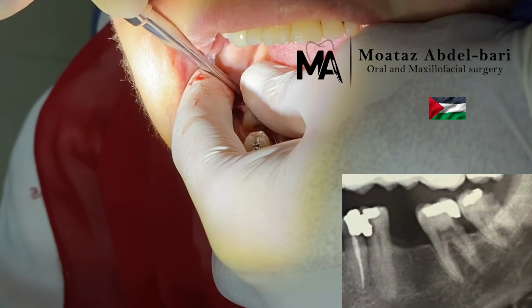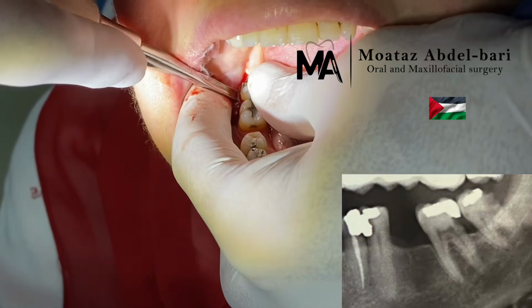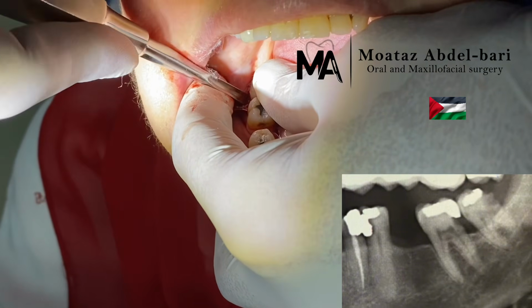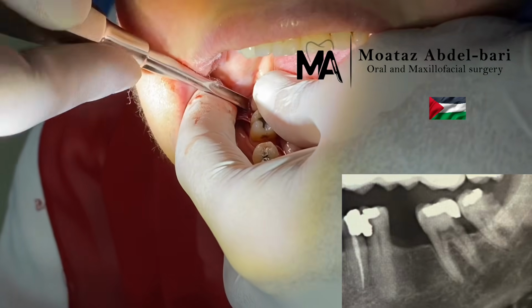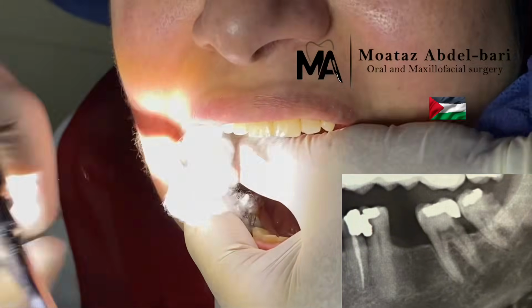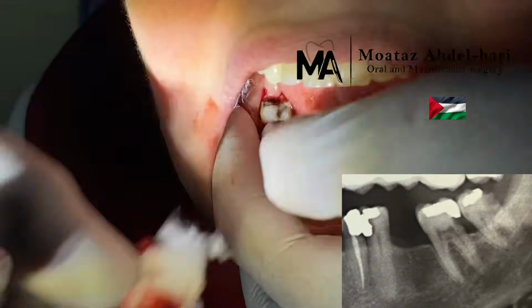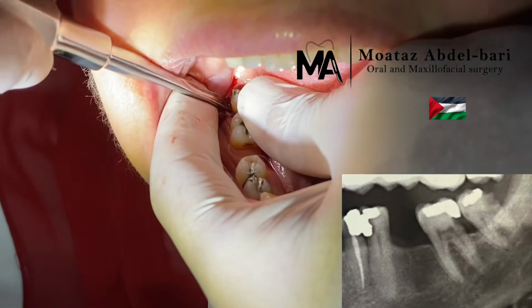Just be delicate and assess what is going on with this tooth. I try to luxate it from the mesial side as well as from the buccal side to assess whether there is intimate contact between the bone and the tooth, or there's curvature of the tooth roots in the buccal or lingual direction.